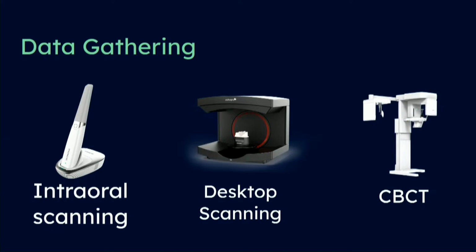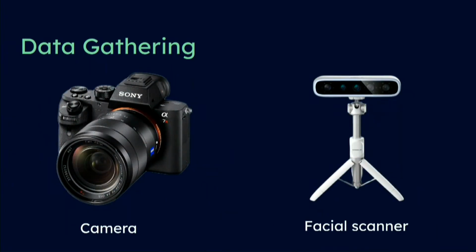and it is especially necessary when surgical procedures like implants or if there is a maxillofacial involvement. It is also worth mentioning that photography and 3D facial scanning are another set of tools necessary for full digitization of your patient.